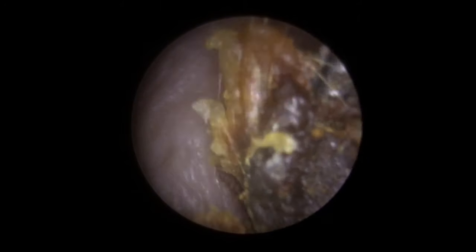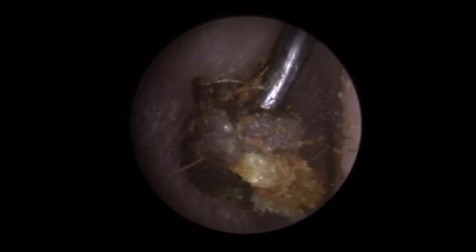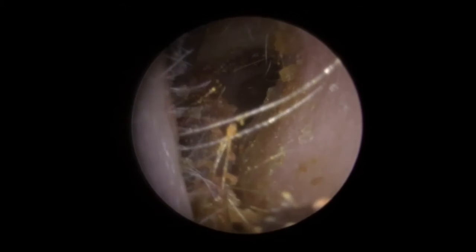Let's wait for that bit to pop through — there we go. You can see it's starting to bring those little straggly bits on the left-hand side with it now. Every time we're going in with the Jobson horn, we're bringing this forwards, bringing the next section forwards. Much safer way of doing this type of extraction — that way we're only working just inside the canal entrance. There you go. I can see a little bit of dry skin at the base there, and a much, much deeper piece further in. There was a lot tucked around the left-hand canal wall.